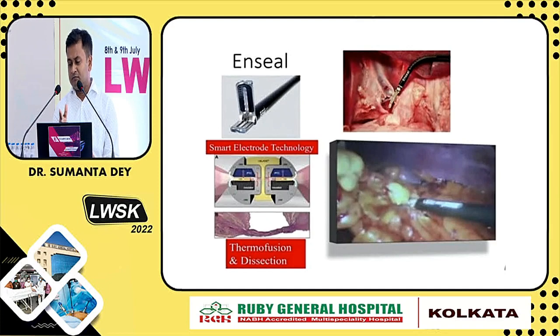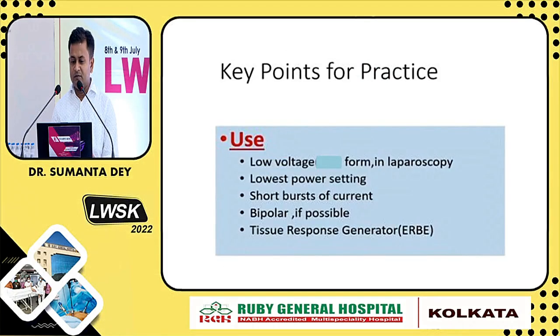It will anticipate the tissue depth, and it will coagulate with thermofusion and dissection. You can dissect, coagulate, cut, you can do everything. So these are newer bipolar devices.